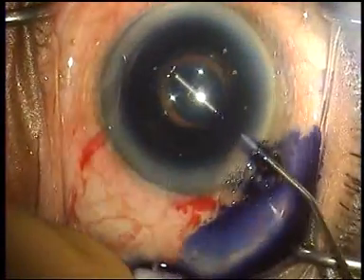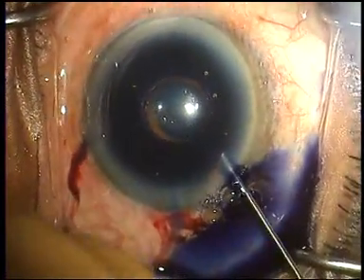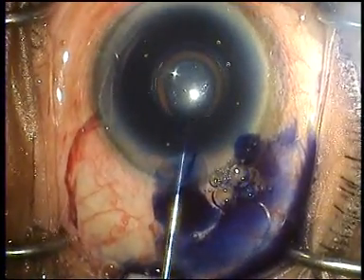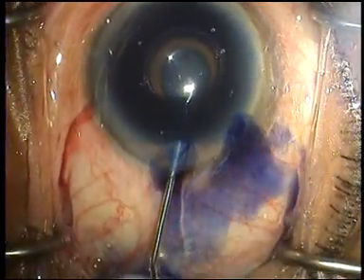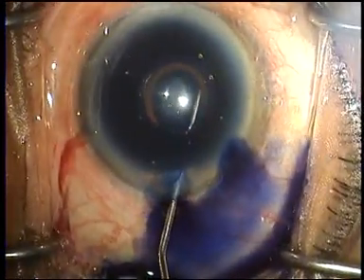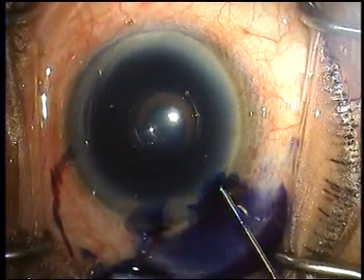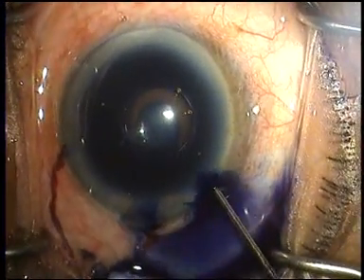We are inserting trypan blue under the iris onto the anterior capsule. Note that we are injecting it under the iris — if we don't do that, all you will get is an imprint of the pupil on the anterior capsule.